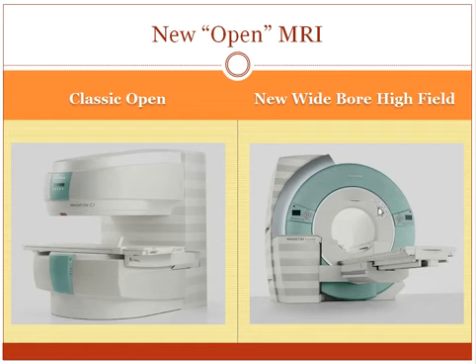Now, an MRI kind of looks like a CT scan at first glance. Both of them are donuts, both tubes, but an MRI scanner is much, much deeper. It's a much larger, heavier piece of equipment, and again, it takes a lot longer to scan. So if you just glance at an MRI versus CT for a few seconds, you may be confused. But if you think about it, one of them is going to be very long and deep and very large. The other one's going to be a very light piece of equipment, very shallow and open.